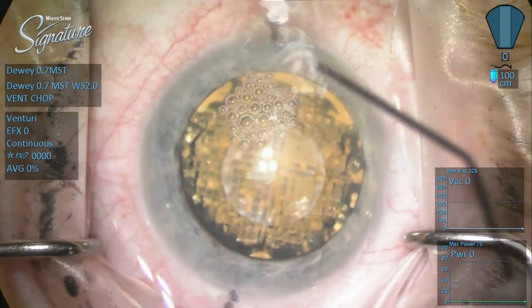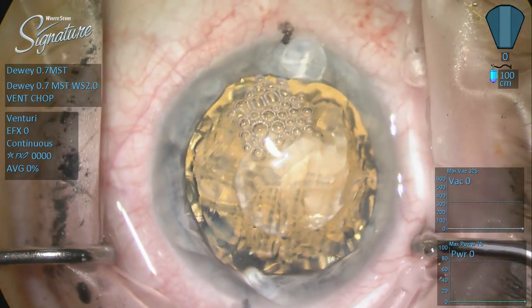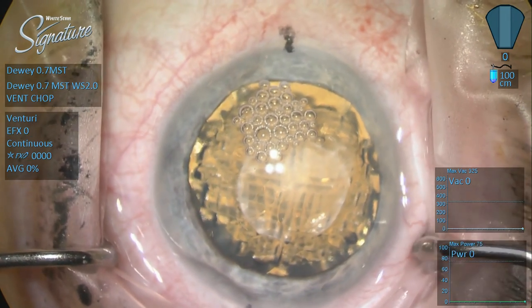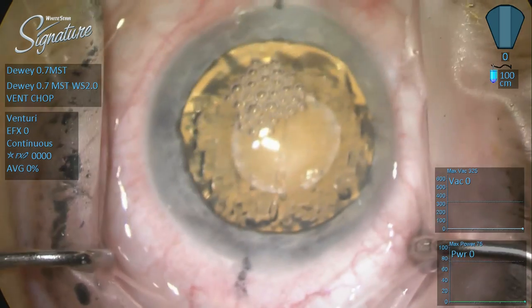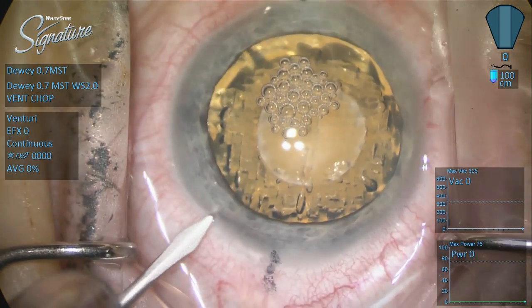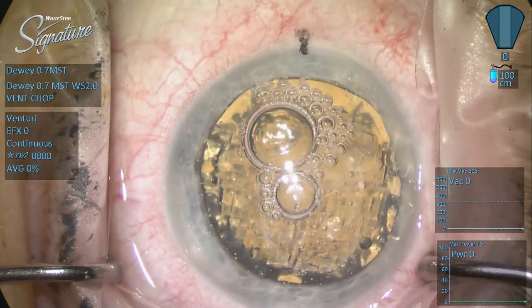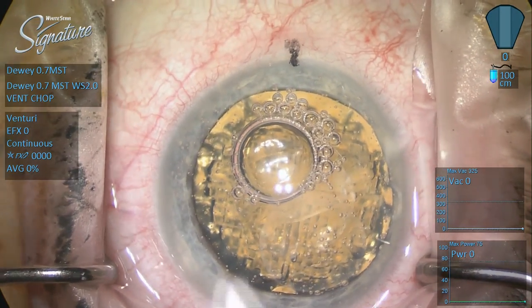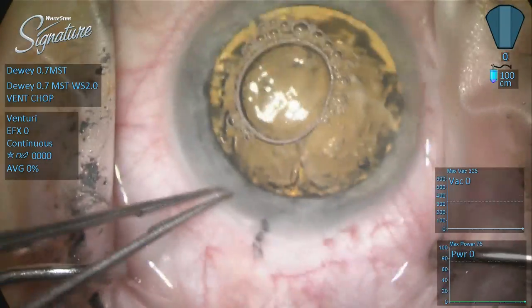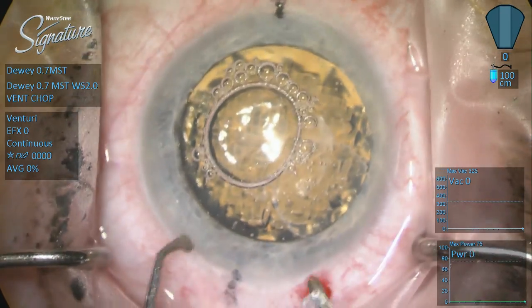After the Catalyst femtosecond laser procedure, you see two black marks at the three and nine o'clock positions. These are placed with a vertically oriented beam at the YAG laser slit lamp in the preoperative area, allowing me to more accurately place the patient interface and align it to exactly the 180-degree meridian, even if I can't get the fiducials to properly align.